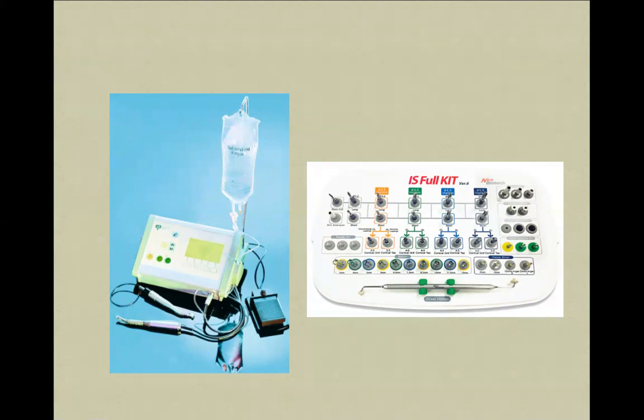And just imagine that you're making a drill hole by your physio dispenser. The standard rate is like 500 RPM, and it is making a drill hole. Of course, here we have overheating. If you do not irrigate it with very cold saline solution, the local temperature will increase and you will face necrosis. Therefore, the drilling of the drill hole for the dental implant should be done by physio dispenser only.